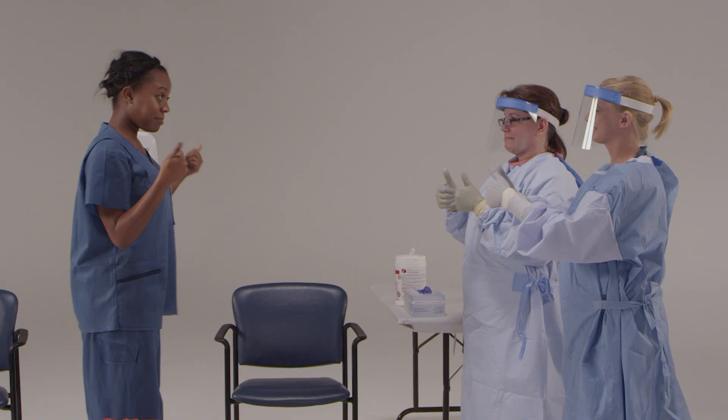Congratulations, you've now successfully finished the doffing process, so you can leave the doffing area. You need to find the closest designated shower, where you can remove your scrubs and bathe with soap and water. A shower is recommended at the end of each shift for the comfort of the healthcare worker.